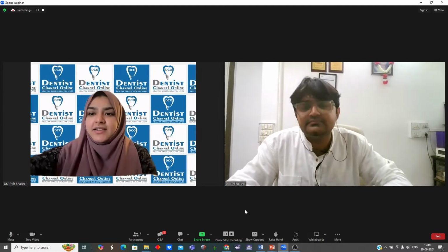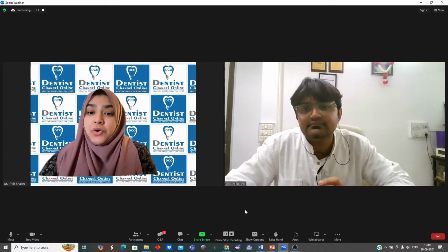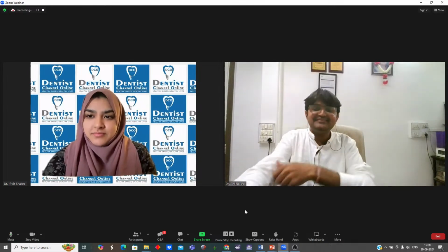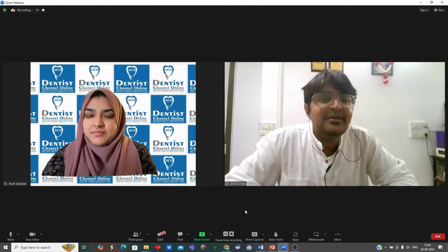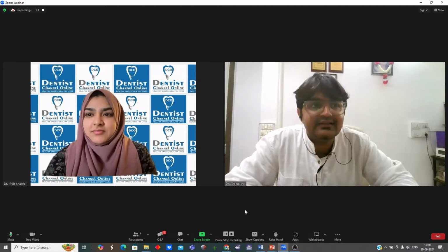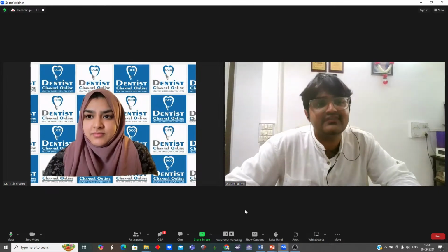The next question is, is CBCT or CT more accurate for assessing the buccolingual dimension of the ridge before implant replacement? Yeah, it's a good question. It's a long talk on that, but to be honest, for normal cases like one implant, two implants, three implants, it's fine. With CBCT and CT scan, there is not much difference.